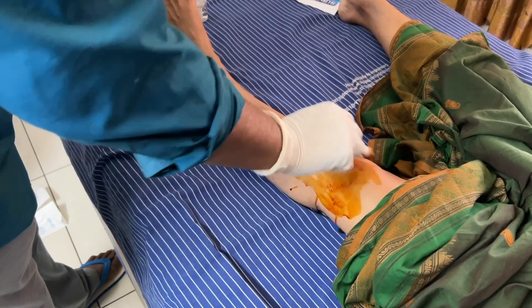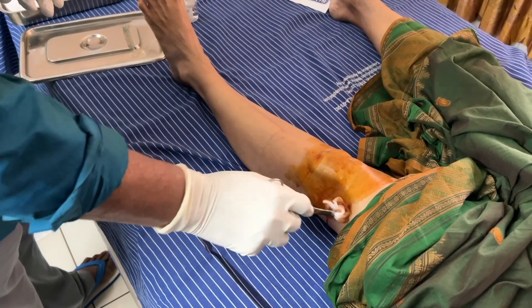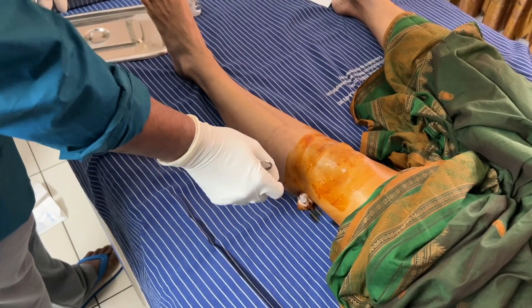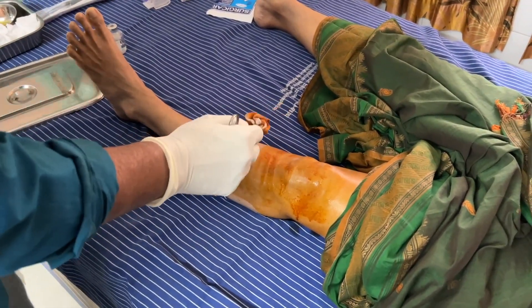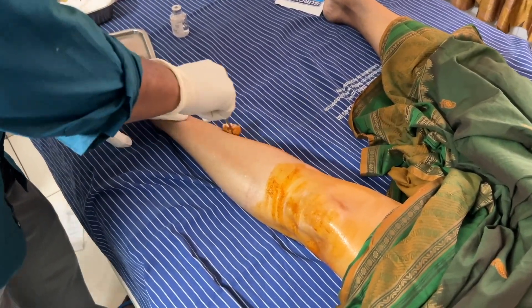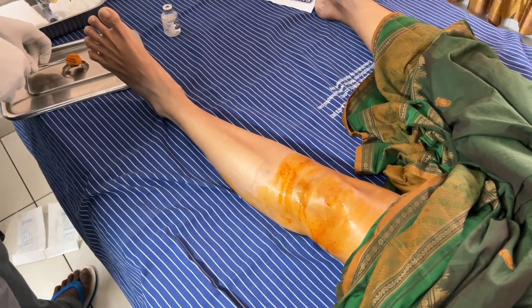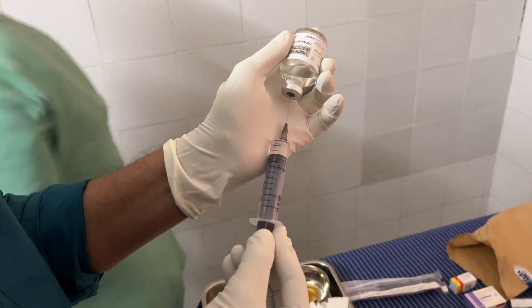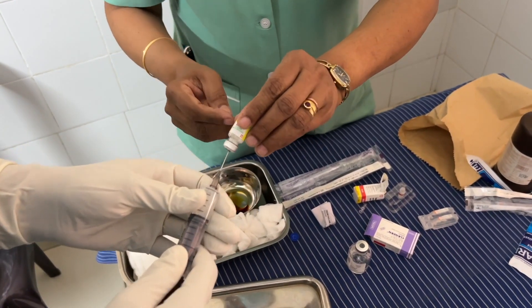Here is a patient with osteoarthritis of the knee with severe hamstring and quadricep spasm, not able to flex the knee more than 30 degrees, extremely painful. MRI showed some changes in the patellofemoral joint and the medial joint line was pretty damaged. She happens to be my aunt; she is 63 years of age, and we are mixing a cocktail.